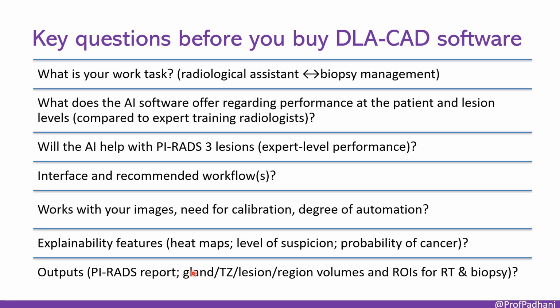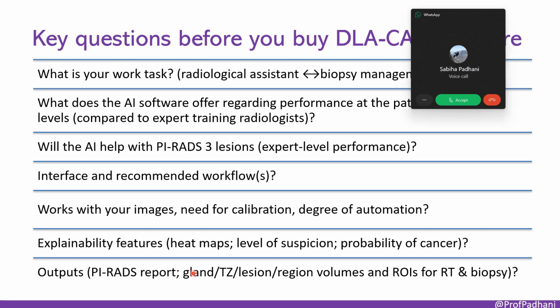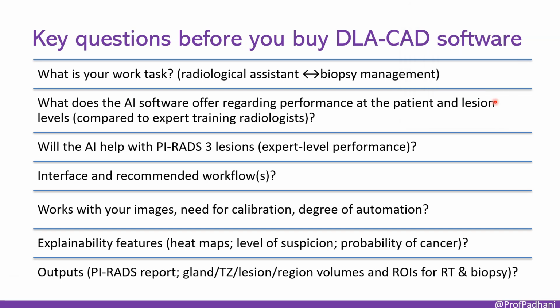Technical compatibility. Yep. Are there explainability features? Can you see heat maps, likelihood scores, anything to help understand why it made a call? Understand the black box a bit. Try to, yes. And finally, what are the outputs? Does it generate structured PI-RADS reports? Does it give lesion volumes? And critically, can it export ROIs or segmentations in a format that's compatible with your reporting system, your biopsy fusion system, your radiotherapy planning system? Interoperability of the outputs, really key. Vital for actual integration. Great checklist.